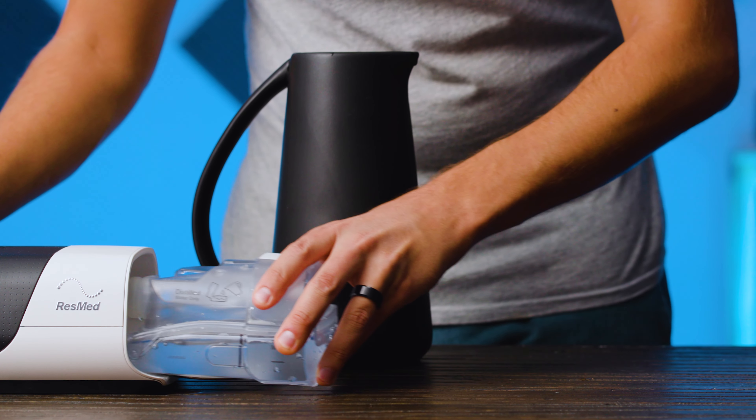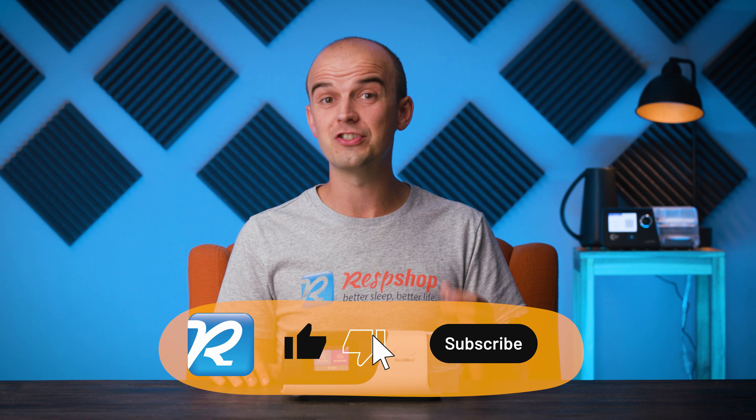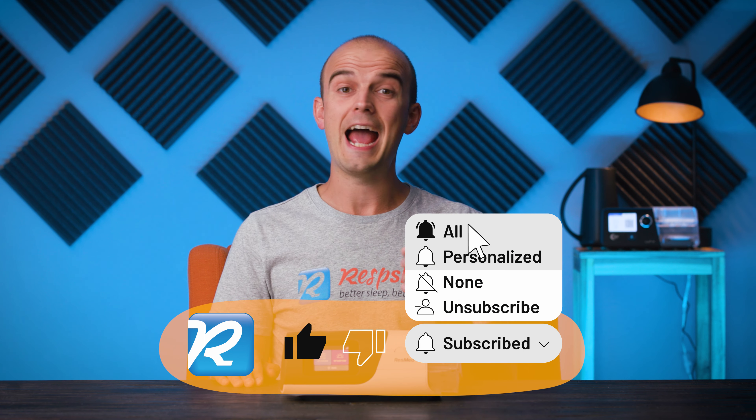Finally, pop the chamber back into the AirSense 11 and you have a maximally filled chamber with fresh water without ever having opened the chamber or spilled the water. Hack completed.